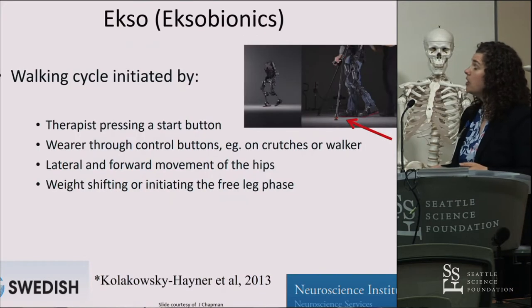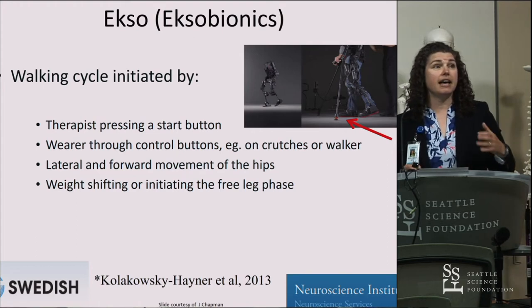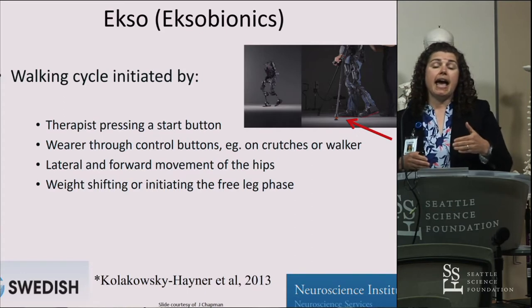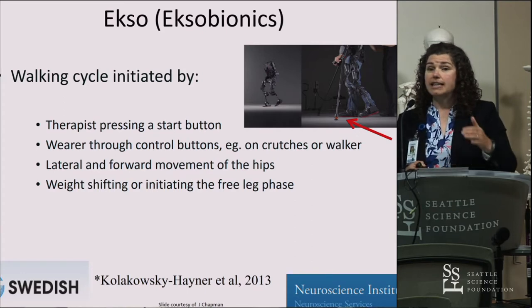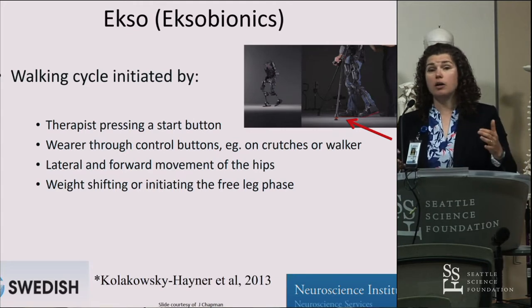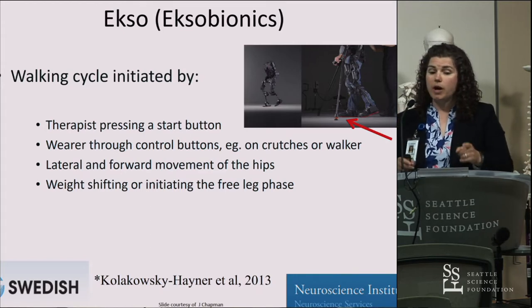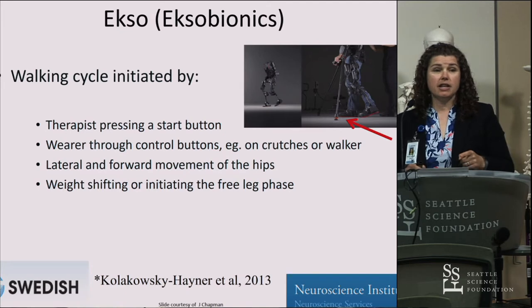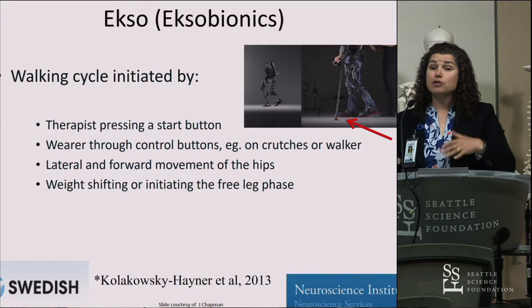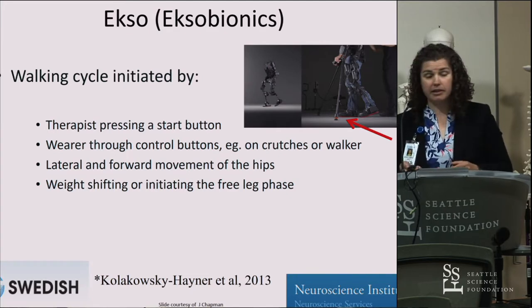There are also overground training devices. So this is an example, the ekso, it's made for rehab where you train overground gait. And there really isn't any literature, at least that Dr. Fazan was able to find, comparing this. So we don't know whether this might be as good as the Lokomat or better than the Lokomat. There is one big study of spinal cord injured patients that indicated that overground training might be better than treadmill training in general. So maybe an overground robot would be better than a treadmill robot, but that's just speculative.